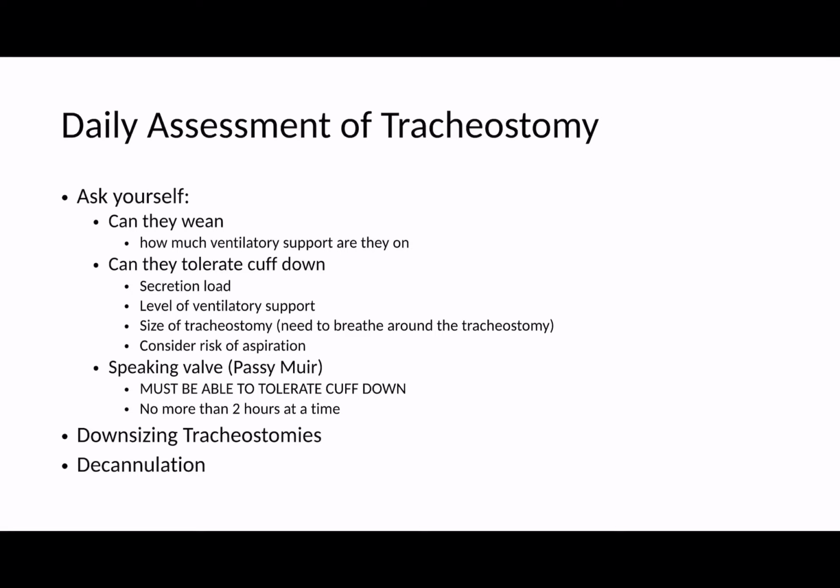And decannulation is something that is usually a combined decision between the consultant or registrar intensivist and the nurses and the physiotherapists who will be working on the chest, looking at the amount of secretions, looking at the amount of ventilatory support that's needed, and looking at the strength of the patient, their ability to take breaths in, generating negative inspiratory pressures, and so on. We'll talk a lot more about decannulation and extubations in later talks.